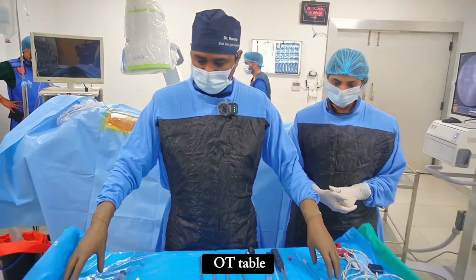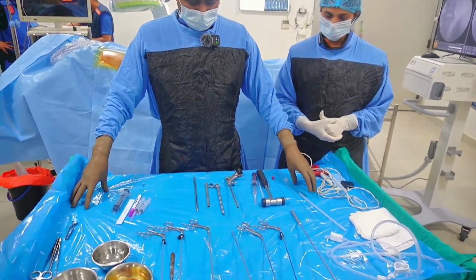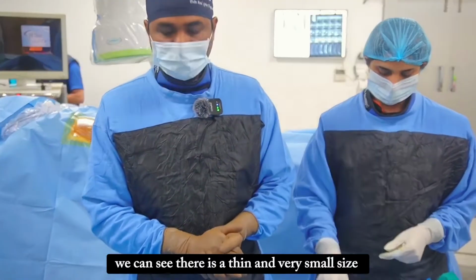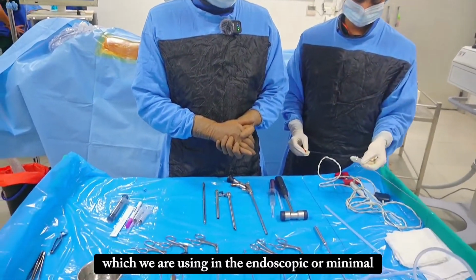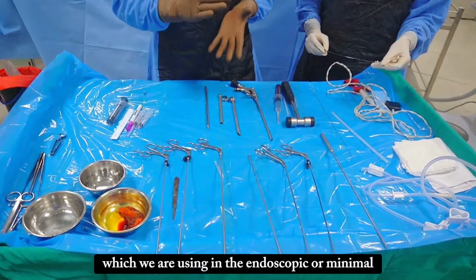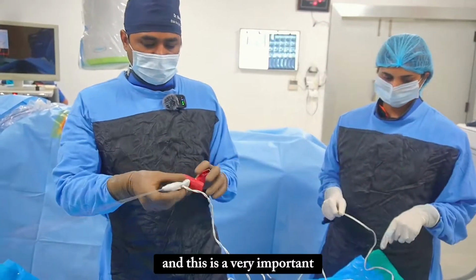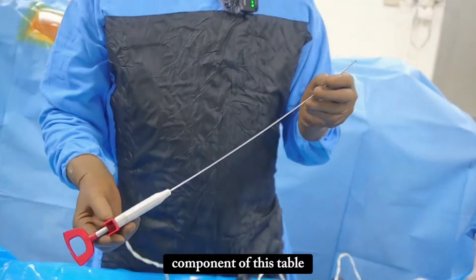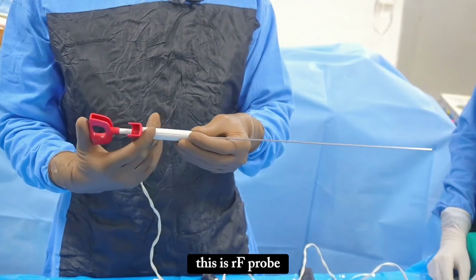This is our OT table. Here we can see the thin and very small instruments which we use in endoscopic or minimally invasive procedures. And this is a very important component of this table. This is the RF probe.